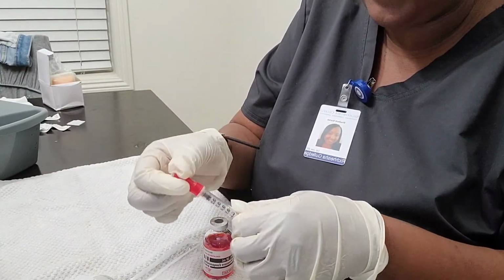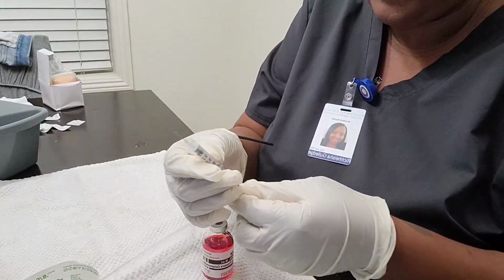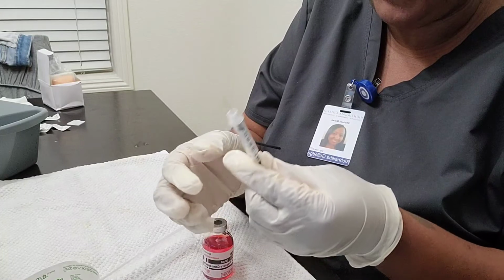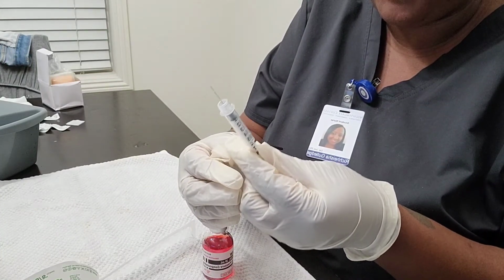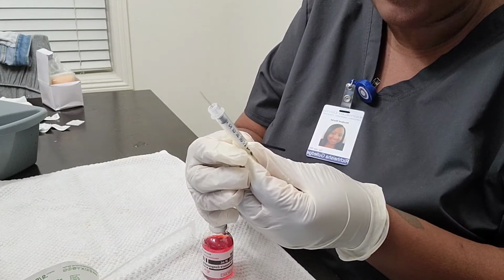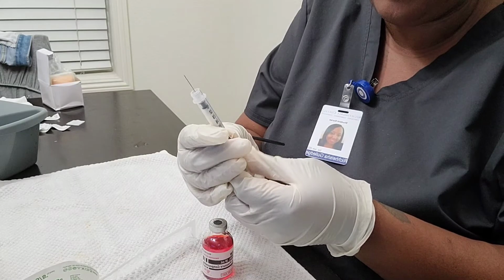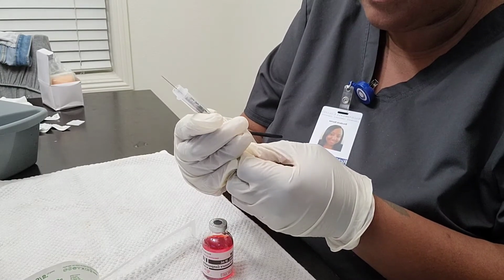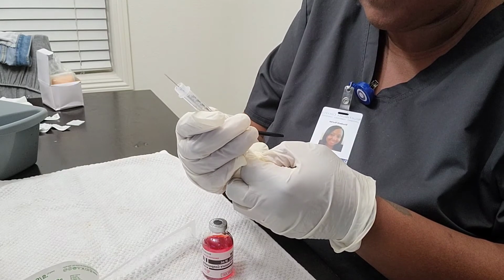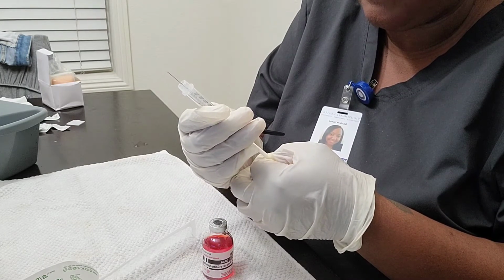Okay, so I will remove the lid, and then I'm going to fill the syringe up with the required amount of air, the same as the medication amount. So pulling that. So if it was a 1.5.